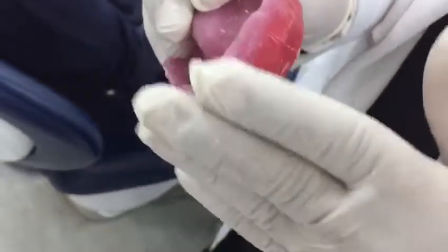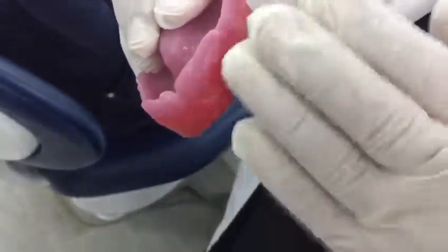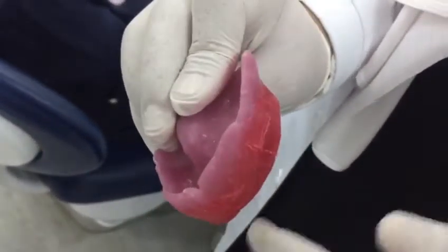After removing the labial flange, take your measurements of the wax for the lip support. Then in the wax-up step, when creating the denture back in the try-in stage, they will refill this area with wax when they are doing the wax-up.